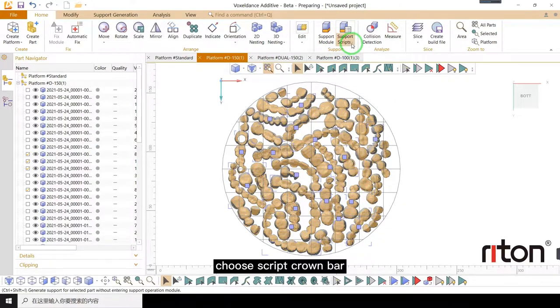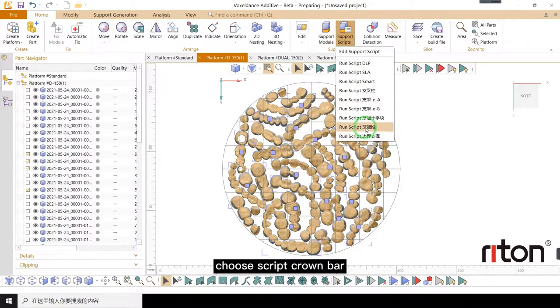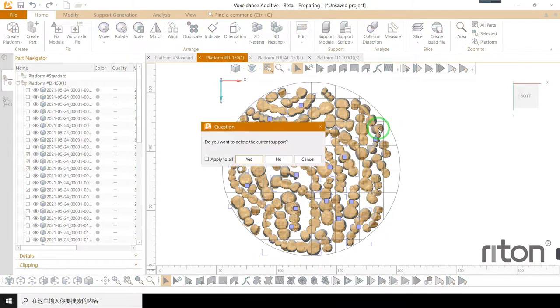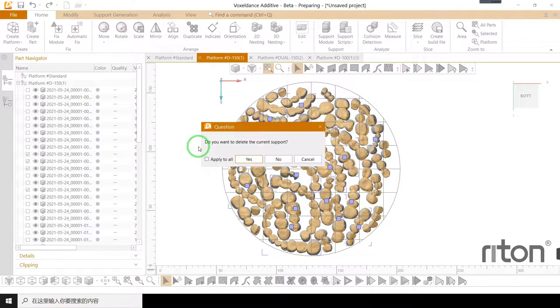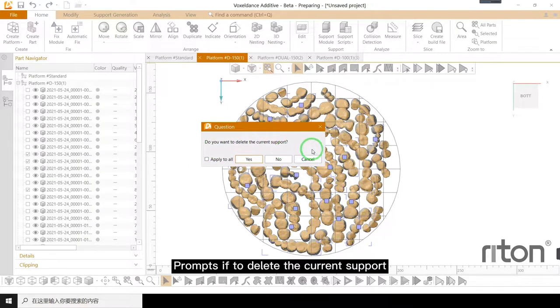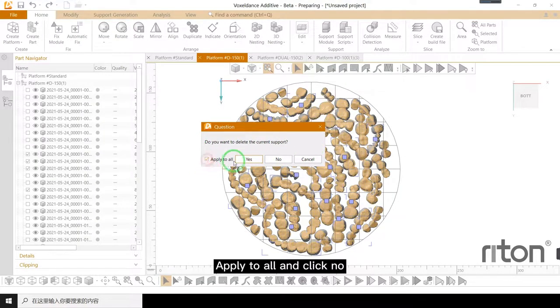Choose script crown bar. Prompts if to delete the current support. Apply to all and click no.